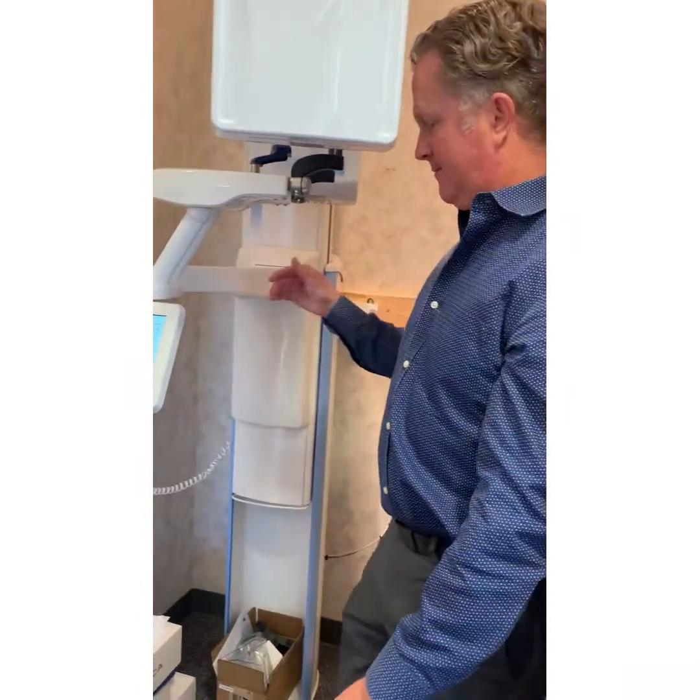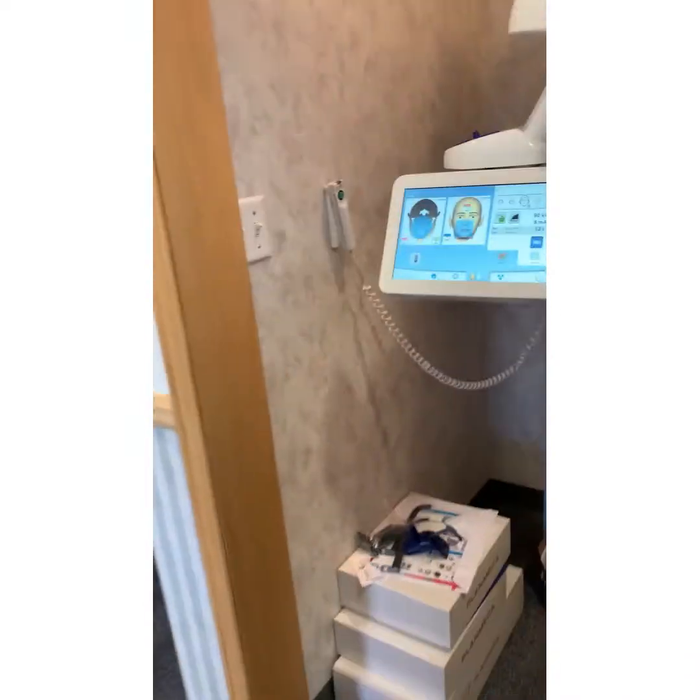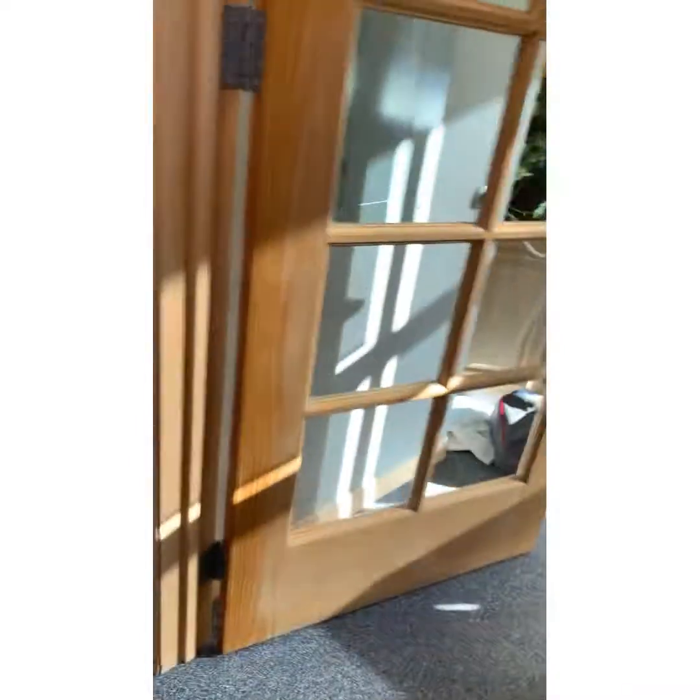We have a patient here who needs an implant. Can we take a scan on her now? Absolutely. All right, let's go grab her. That'd be great. I think she's getting it. Okay. So that was Pam. Pam was about to get, yeah.